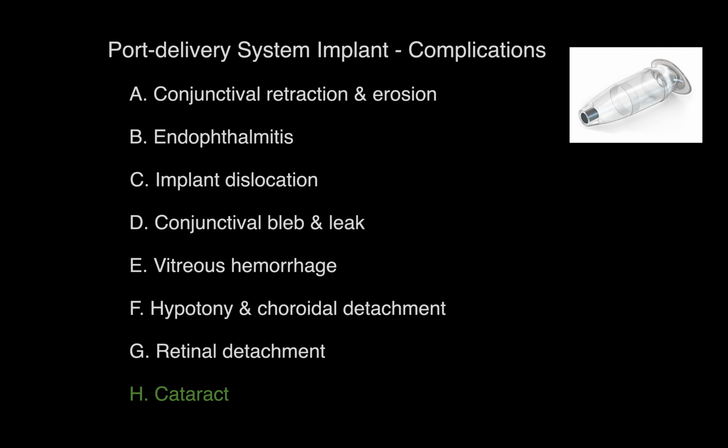In summary, we reviewed the 8 complications associated with the PDS implant.